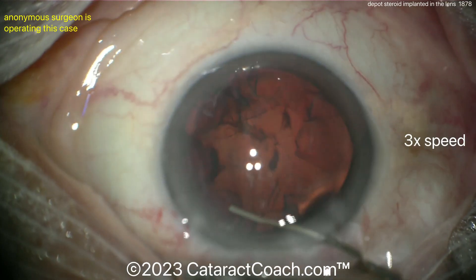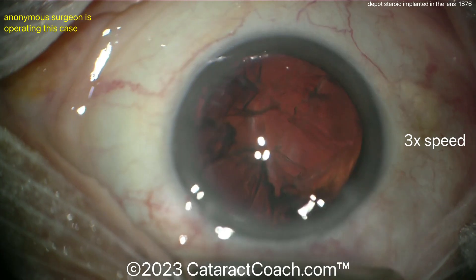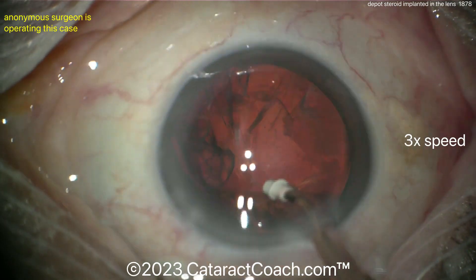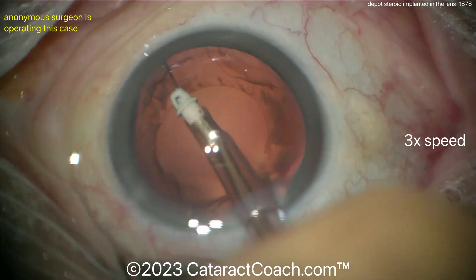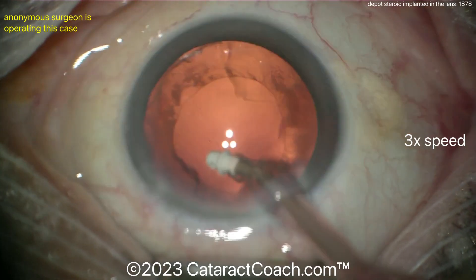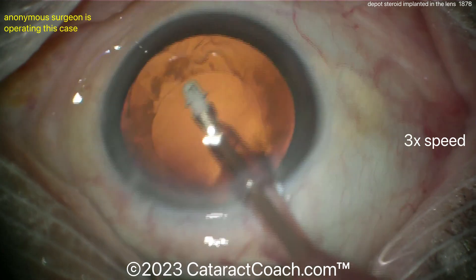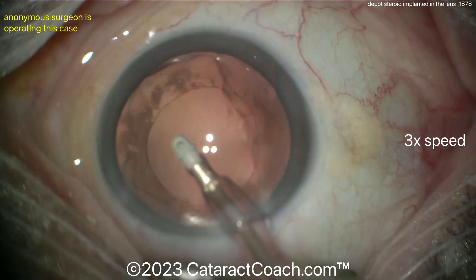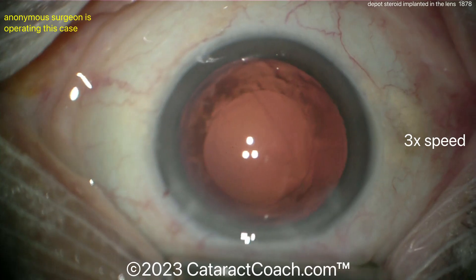Kind of treating this like a posterior polar cataract case. With more and more patients receiving depot steroid implants as well as intravitreal injections of anti-VEGF medications and steroids, we're going to see a lot more of these. There are great videos on cataractcoach.com on dealing with a compromised capsular bag from a misplaced intravitreal injection — including one with Professor Tom Oetting from Iowa, who gives a fantastic framework for handling those tough cases.